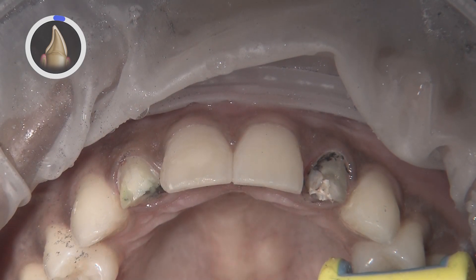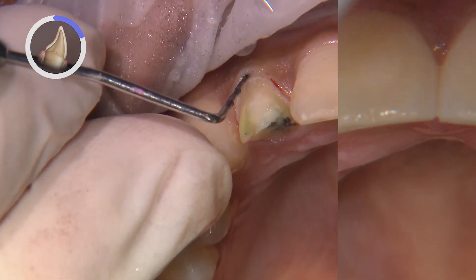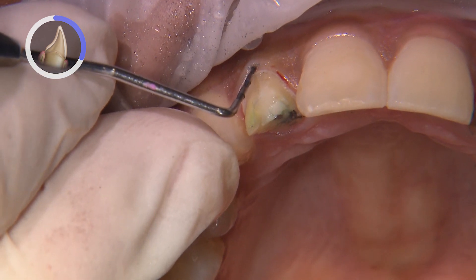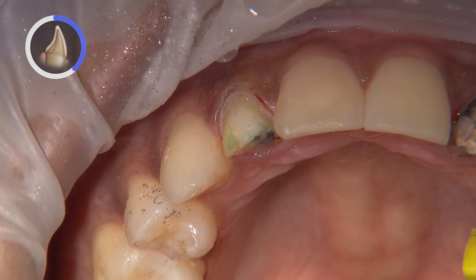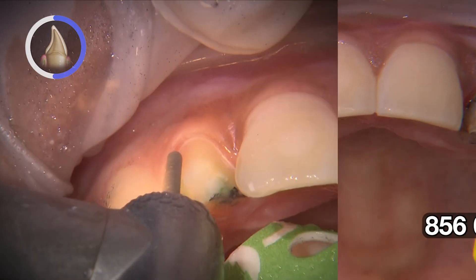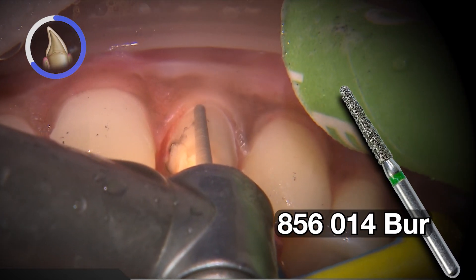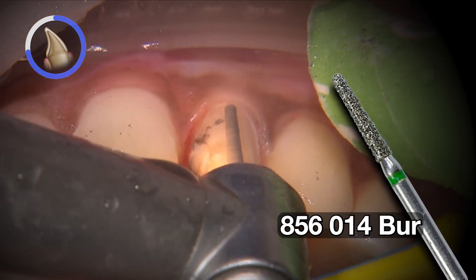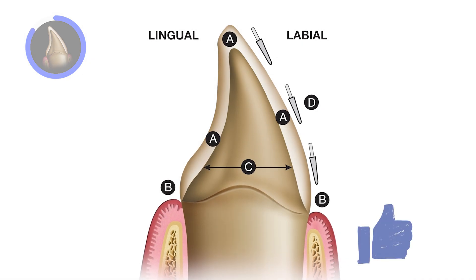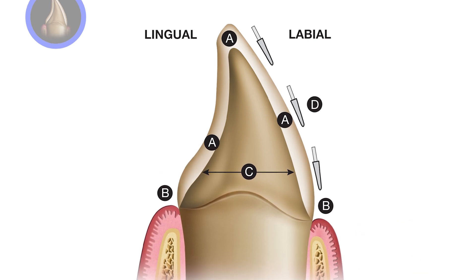Once the crowns are removed, it's time to refine the preps and also to modify the buildups if necessary. The gingival zenith on number 7 is about half a millimeter lower than number 10, so I'm just checking the sulcular depth with the probe to make sure I have enough room from the attachment to raise the margin. For all my preps, I use a round-ended tapered diamond bur to create the appropriate depth and rounded internal angles along the axial surfaces, which will result in a deep chamfer margin. For Bruxer Aesthetic, we're looking for a reduction of about 0.7 millimeters along the gingival margins and a 1.5 millimeter clearance.